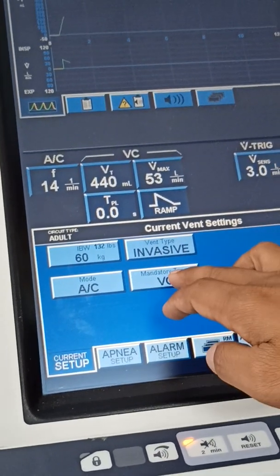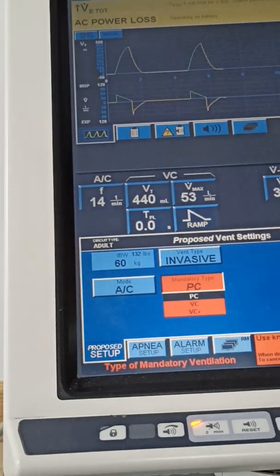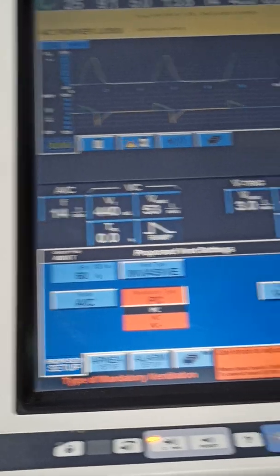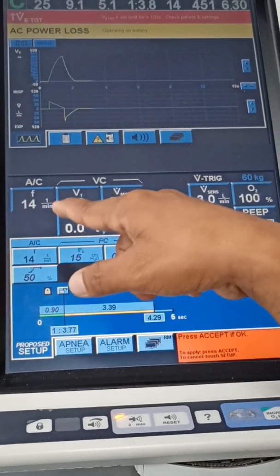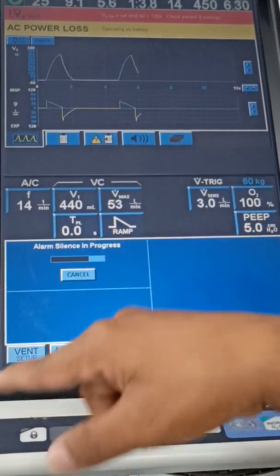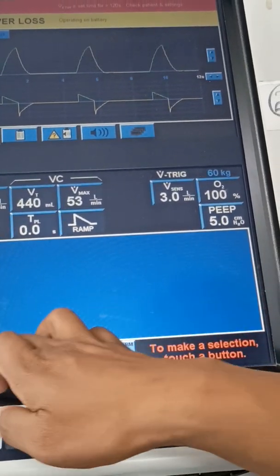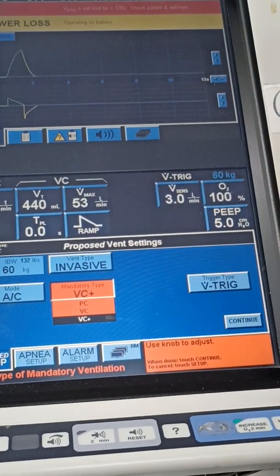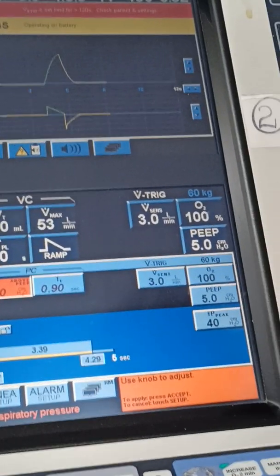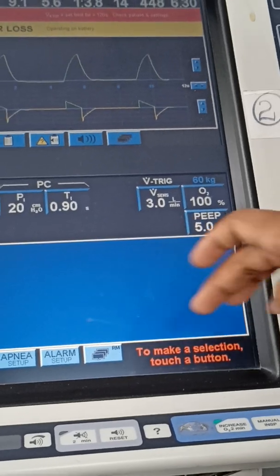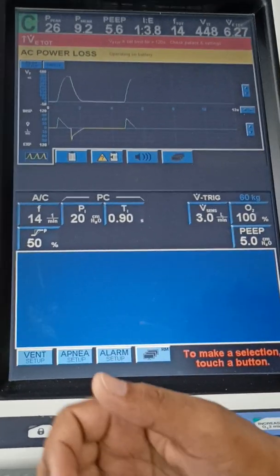If you want to change from volume control to pressure control, go to ventilator settings, select invasive, select pressure control, and press continue. The options will change — previously in volume control there was a tidal volume setting, but in pressure control you have to give the pressure value instead. Set the pressure and accept it, and the mode will be changed. That's all about the basic ventilator settings.